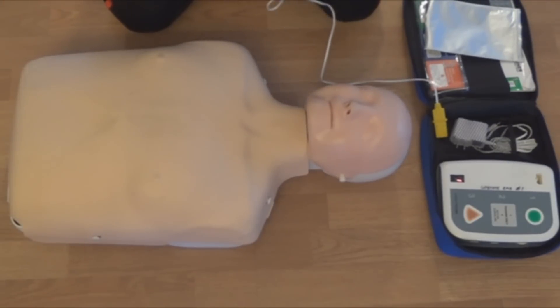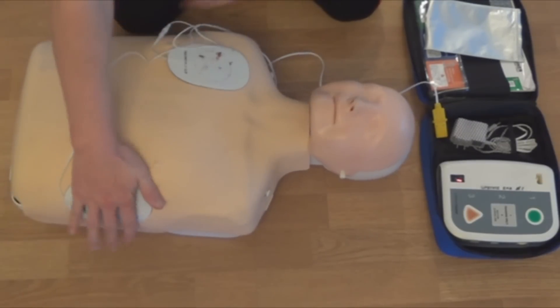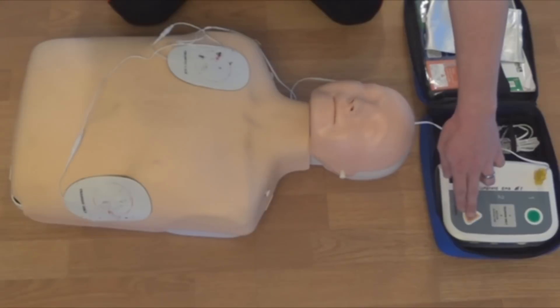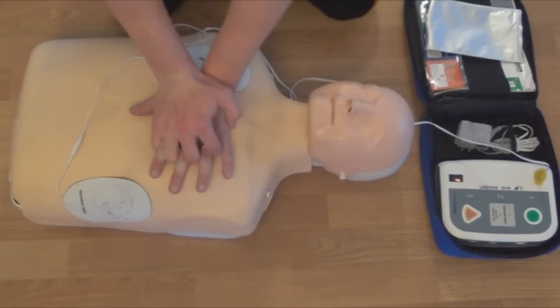Apply pads to patient's bare chest. Plug in pads connector next to flashing light. Analyzing heart rhythm — do not touch the patient. Shock advised. Charging. Stay clear of patient. Deliver shock now. Press the orange button now. I'm clear. Everybody's clear. Shock delivered. Begin CPR.